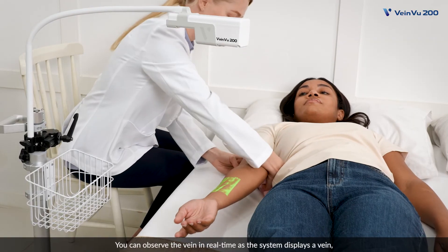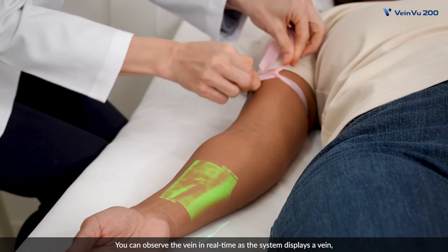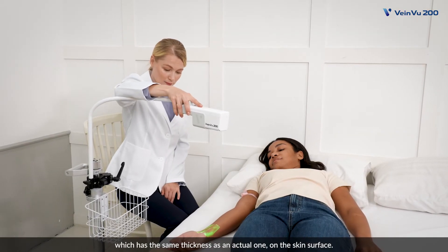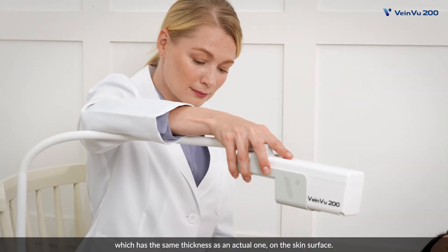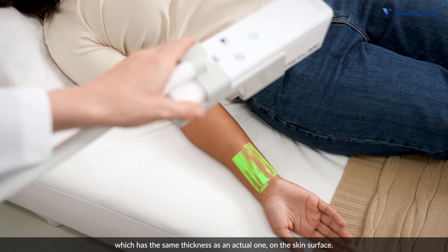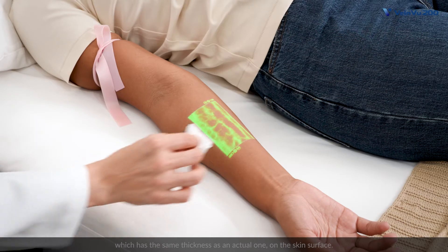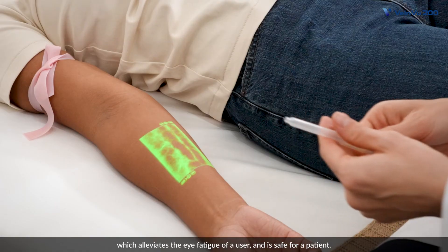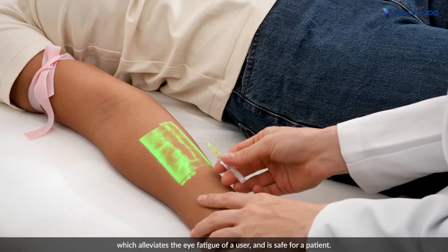You can observe the vein in real time as the system displays a vein which has the same thickness as an actual one on the skin surface. VeinVu 200 works based on an LED light source, which alleviates the eye fatigue of a user and is safe for a patient.